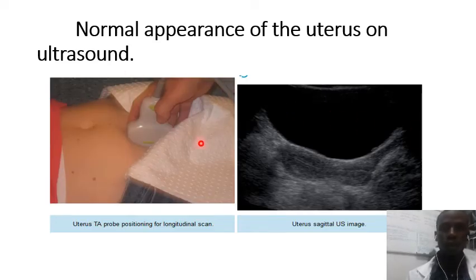still on ultrasound, when you are in the sagittal plane and you are pressing your probe inferior to the umbilical stump, then this is the image of the uterus which you get, using the urinary bladder as your acoustic window. So this is the uterus, which is continuous to the vaginal canal. You can see how this anterior border is smooth, and again at its fundus, then its posterior wall, and then finally this inferior aspect.